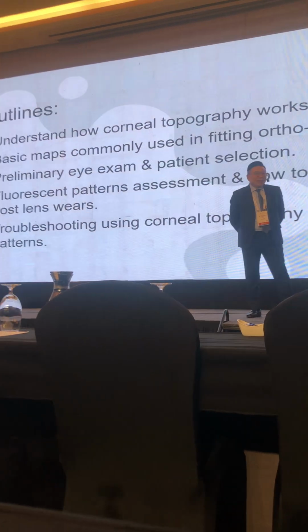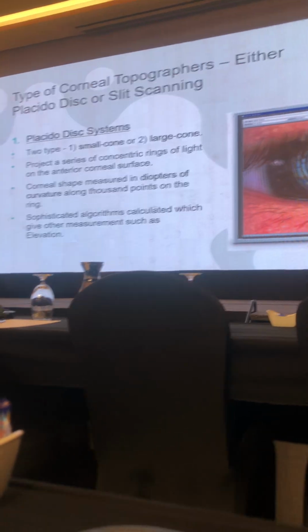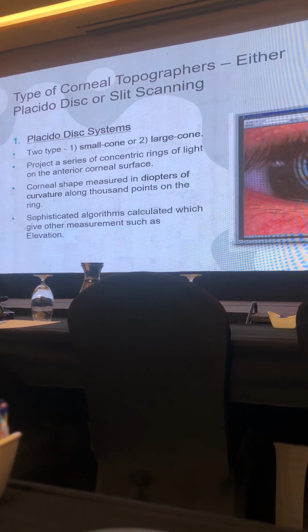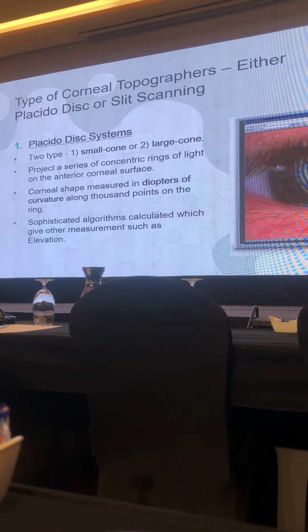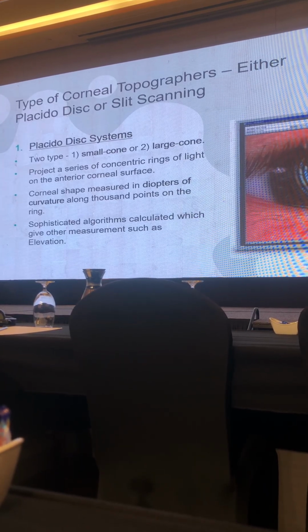Okay? Steve, we've been known, we never fit the right lens on the patient's eye. We always fit the wrong lens. We always intend to fit wrong. And then you understand how to rectify it. Good. Okay, a different kind of topography.